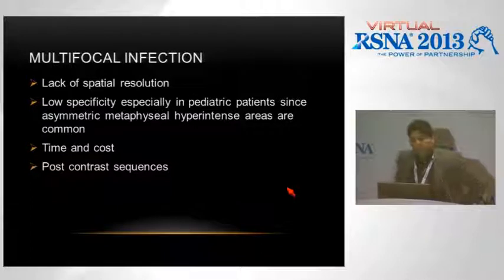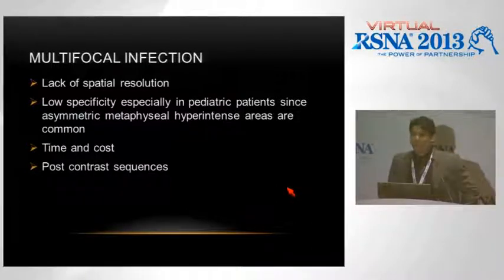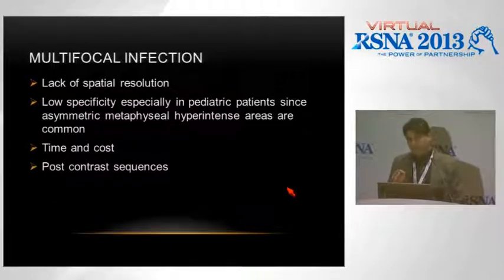Multifocal infection. This was the short story that I was mentioning to you earlier. My ID physicians ask for doing whole body in children all the time for infection, and this is something we sort of discourage just because of the lack of spatial resolution. Clearly there's a time and cost associated with it, and it does have low specificity at times because of the asymmetric metaphyseal hyperintense areas, which are so common in children.